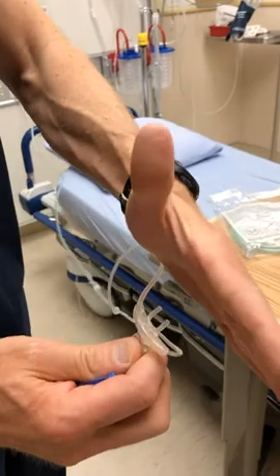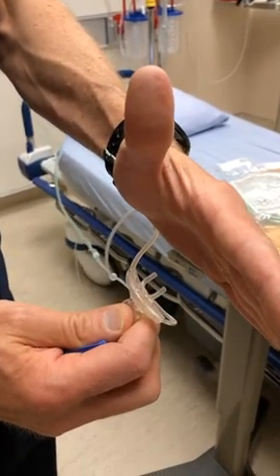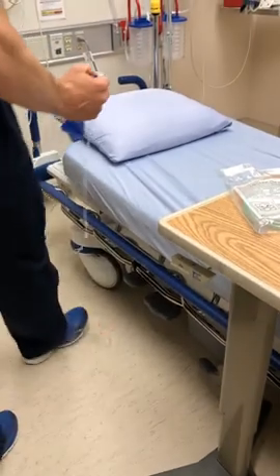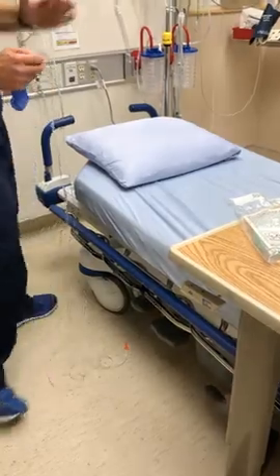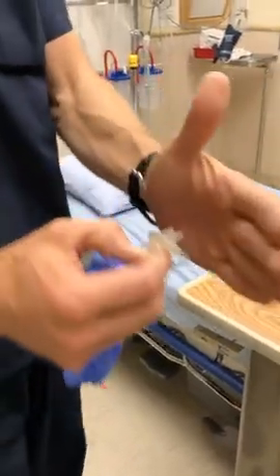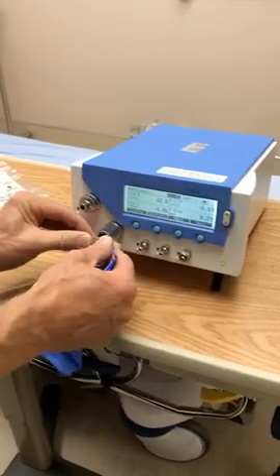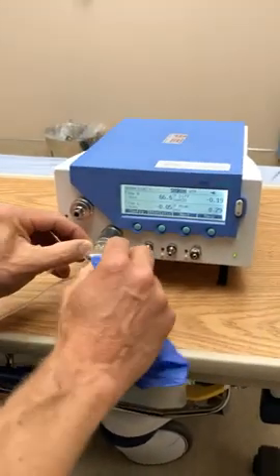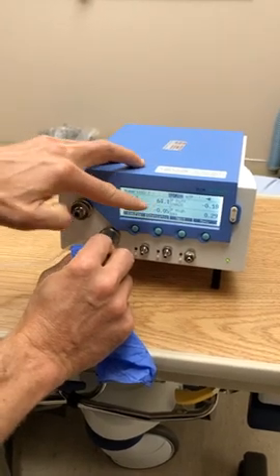I can feel that flow on my hand — just listen to the sound change when I crank the flow. So I'm going up well beyond the 15 liters here, and that is just way more flow. I'm going to try and see if we can get it measured here. You can see the flow is really high.